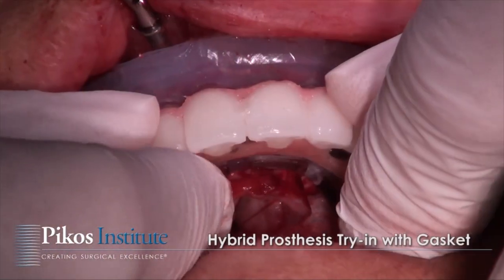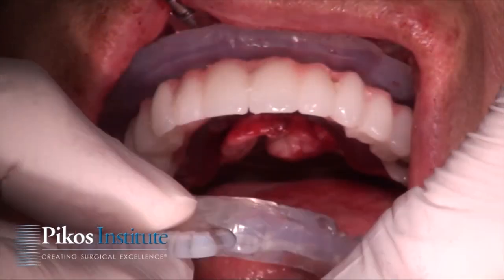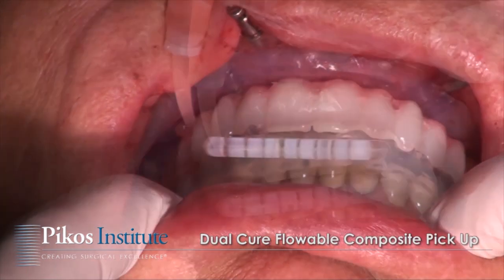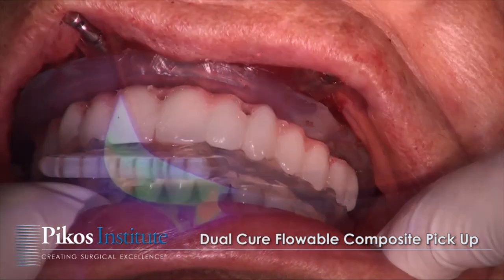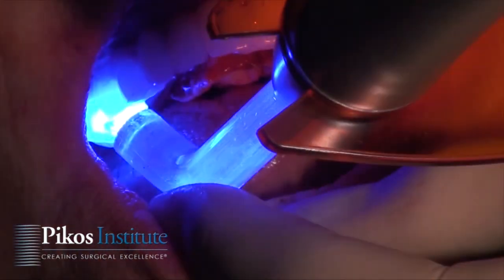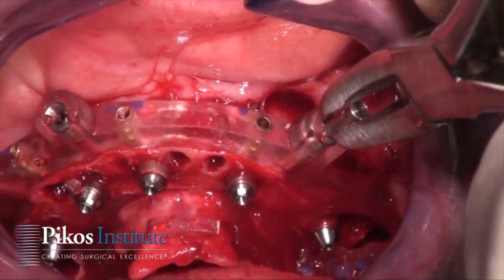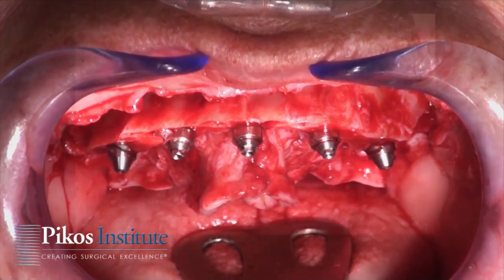And now, as we're showing the copings in place, there's a gasket that's there to prevent extrusion of any flowable material that we use to pick up the prosthesis. We're indexing this arch now against the opposing arch and using our flowable composite for pickup. Done in a very precise manner. So thus, it's more a refinement of this prosthesis that's going to be done once it's now removed from the arch. And while that's being done by my restorative colleague, you will see then surgically I will be grafting any residual defects and getting primary closure.